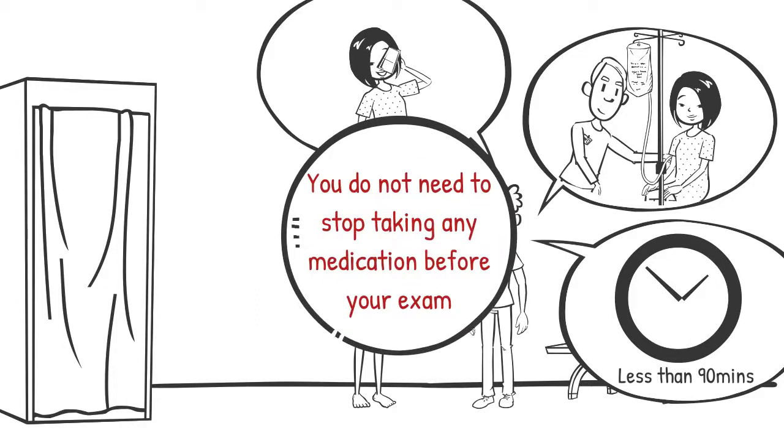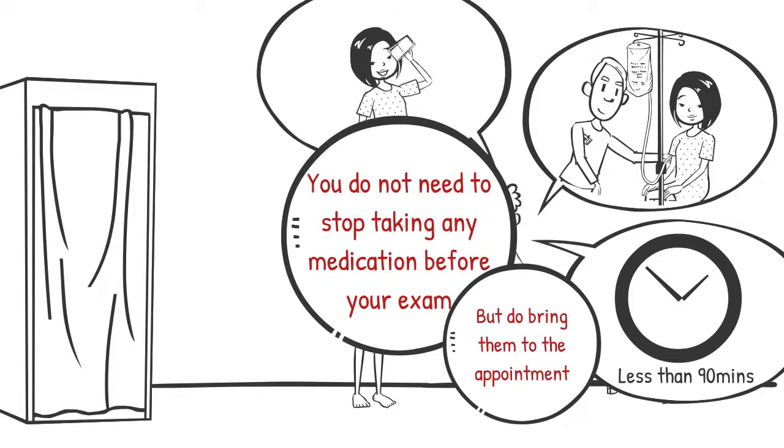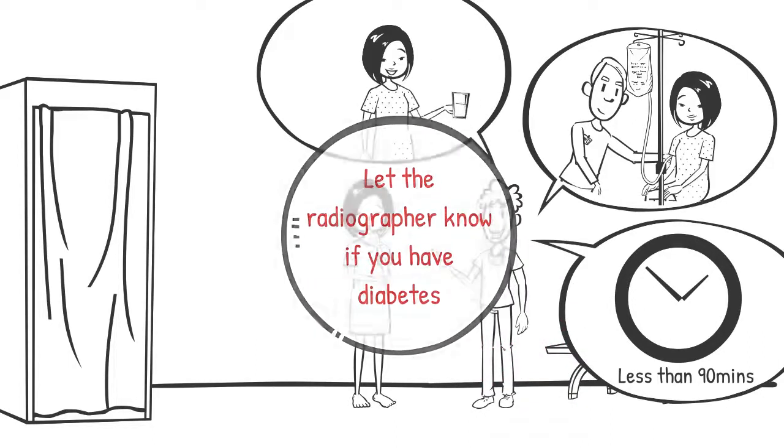You do not need to stop taking any medication before your exam, but ensure that you bring with you any medication, sprays, inhalers, etc. to your scan appointment. If you have diabetes, please tell the radiographers on arrival.